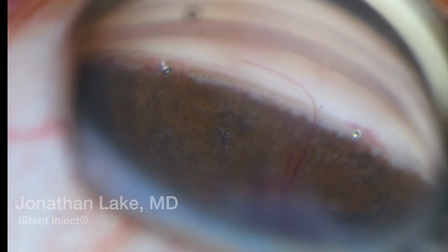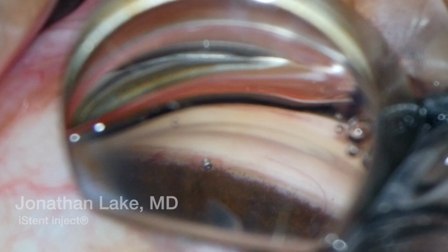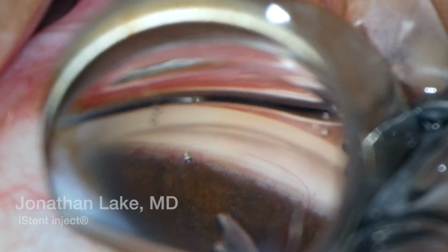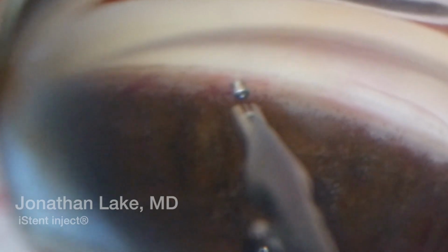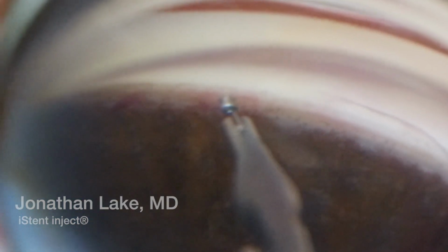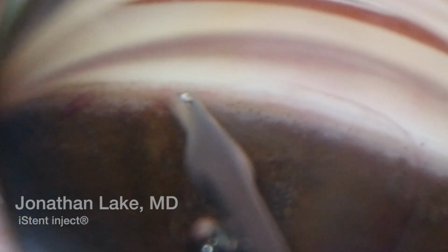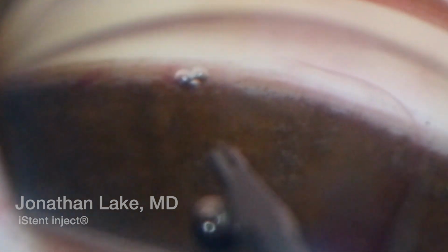So what we do is we'll use the previous charge. We have two more charges within the injector. I'll expose the trocar, and what we do now is we thread or we pass the trocar inside of the stent very slowly, carefully, and now I push in, I indent with a little bit more strength but not too much strength, and once again we have the bubbles.